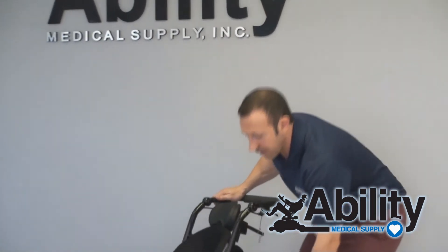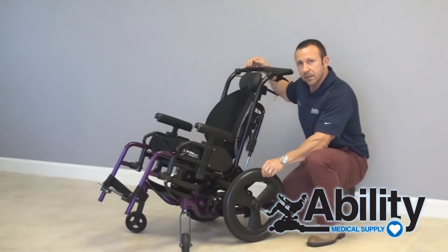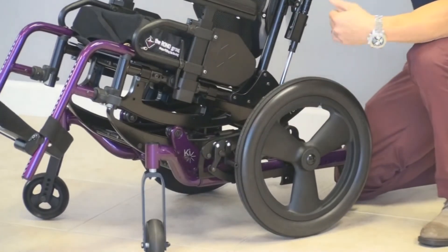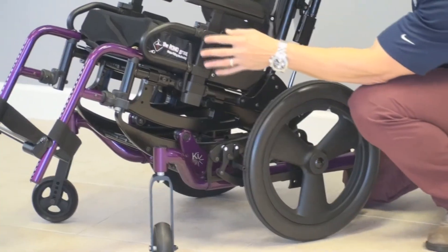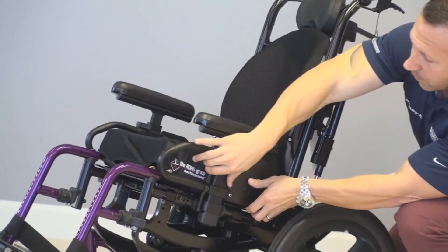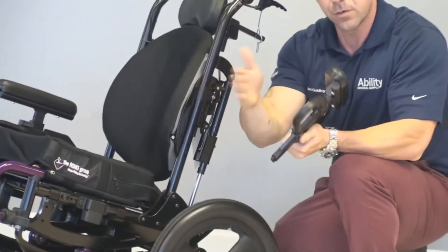We also have nice robust rear wheels and front casters making for a smoother ride. And here we have a nice adjustable height, removable arms, which is also great for transfers.